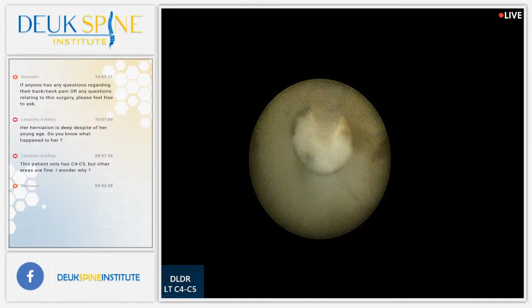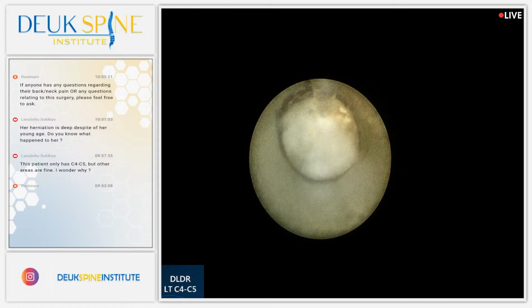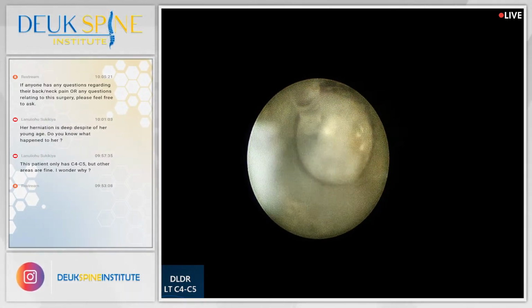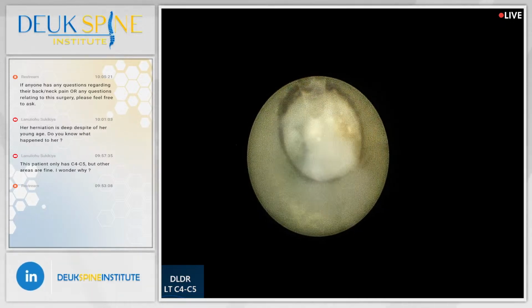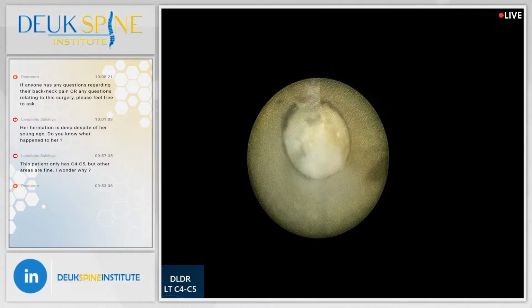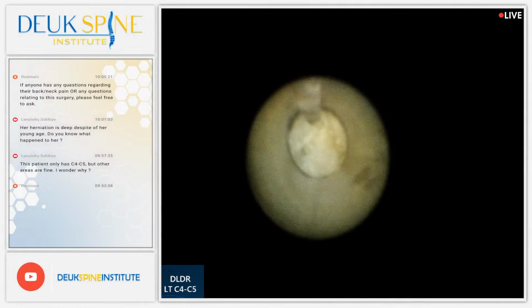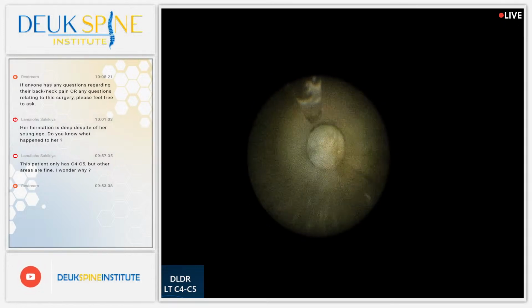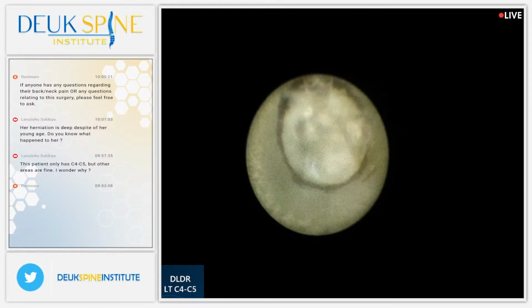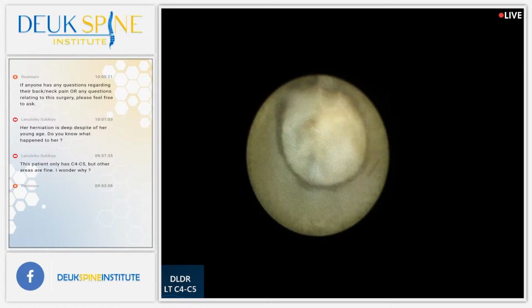If you have questions, I'm happy to take them. Once again, that fiber that I was pointing out right there, that is half of a millimeter. It's 0.5 millimeter, just to give you an idea of the precision of this surgery, how precise it really is. It's extremely precise. I'm just adjusting my focus to improve it. We're using a camera and an endoscope. So this is endoscopic spine surgery.